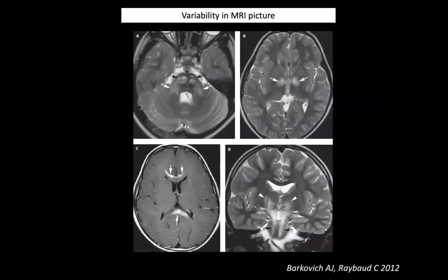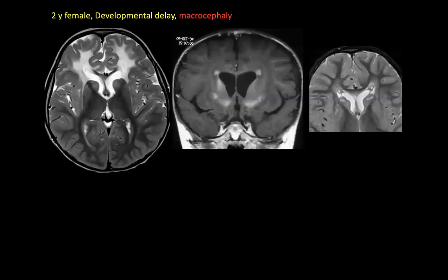And remember also the variability of the MRI picture. There are several patterns that Dr. Loes describes. Sometimes the corticospinal tract is involved, sometimes it's more anterior or the posterior fossa. So you need to keep this in mind. Don't forget there are exceptions to the rule of posterior involvement in ALD. Another very important involvement is the anterior involvement. And again, don't forget the bigger picture.